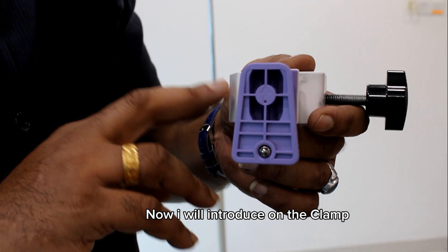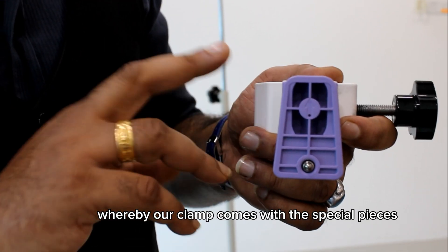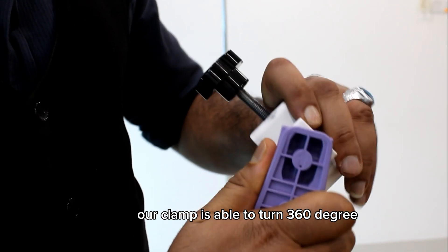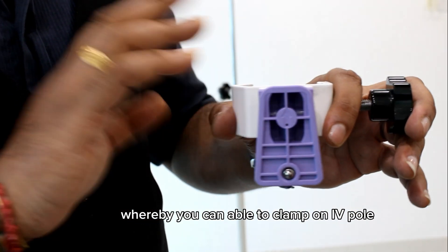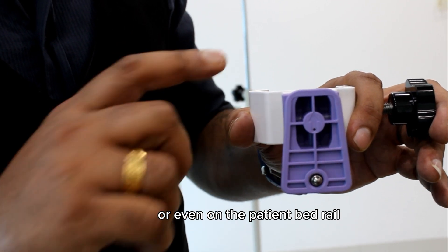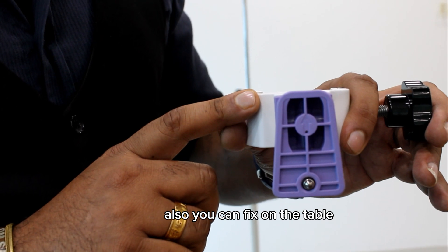Now I will introduce the clamp used on the feeding pump. Our clamp comes with special features whereby it is able to turn 360 degrees, so you can clamp it on an IV pole, on a patient bed rail bracket, or fix it on a table.